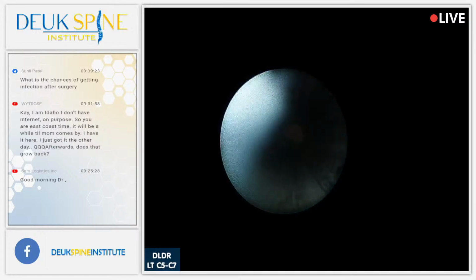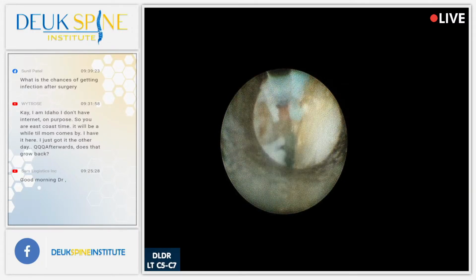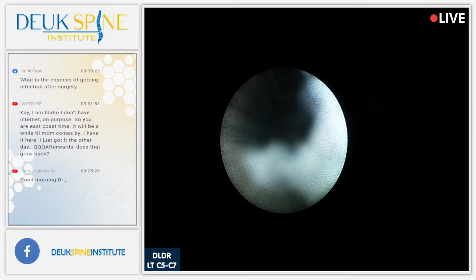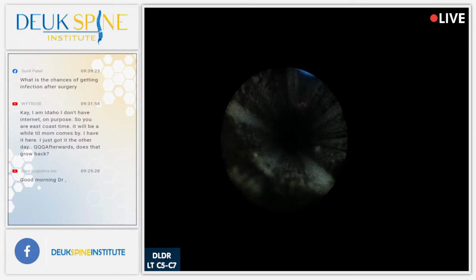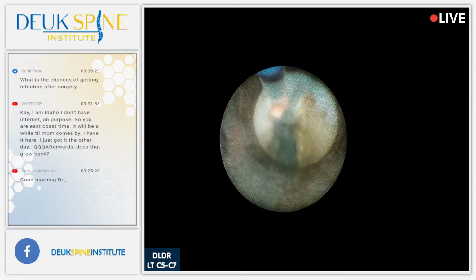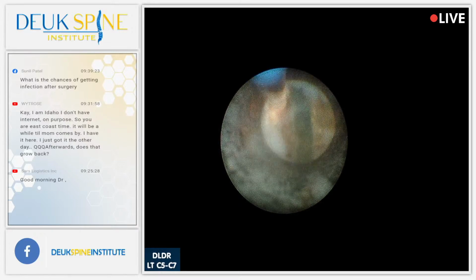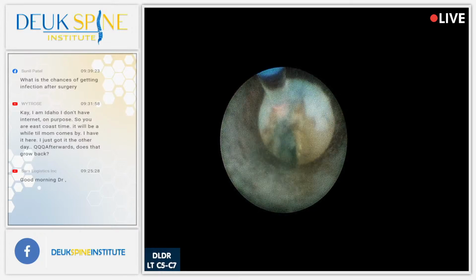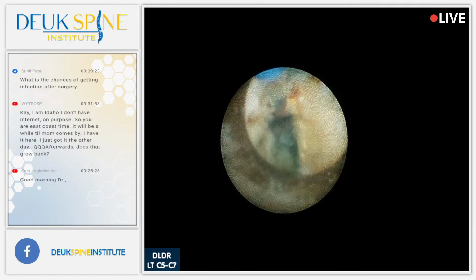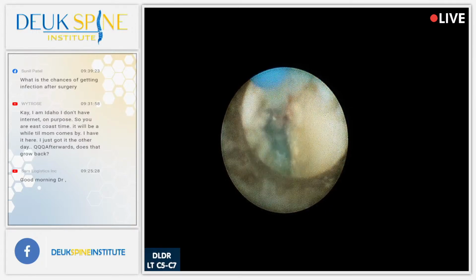All right, there's another herniation. You see that herniation was pushing on the nerve. It was causing a narrowing of the spinal canal, more herniation. All these herniated pieces are where the neuroforamen is. It's where the nerves are, so they are taking up space they shouldn't be taking up. That's like normally you're living in your house with you and your mom, and then 50 more people show up suddenly and try to live in your house. You would have stenosis of your house, or narrowing. You would get narrowed out because there's too many people. So we're going in there and removing all the people who aren't supposed to be there.